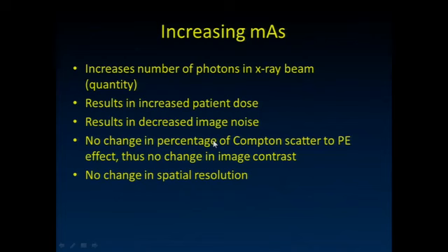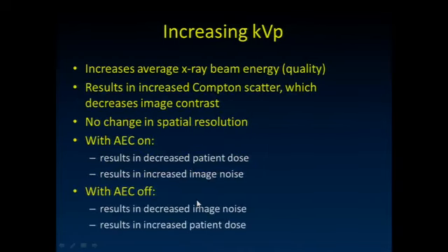It has no change in the percentage of Compton scatter to photoelectric effect, and therefore no change in the image contrast, just decreases the image noise. And there's no change in spatial resolution.